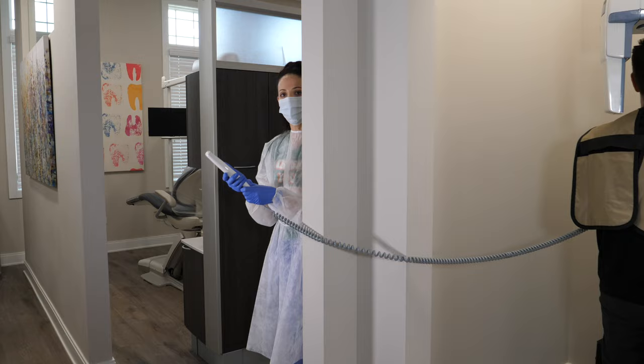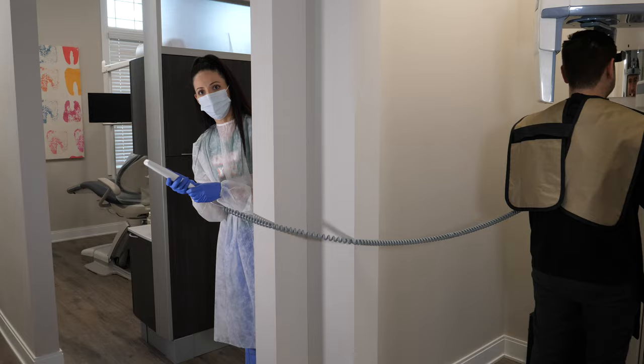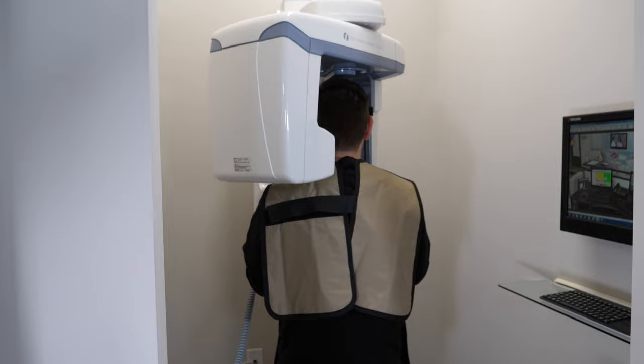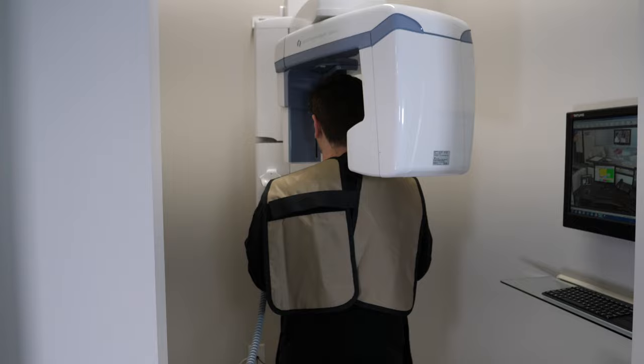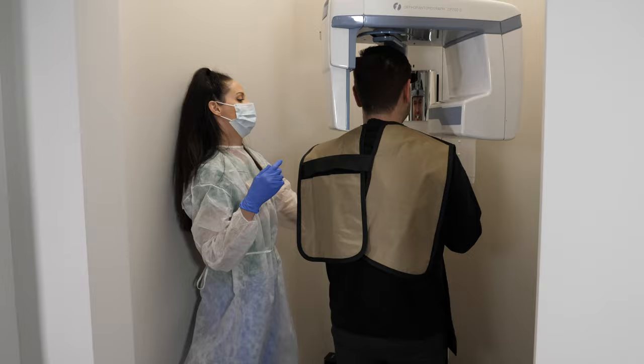Once you are all set up, they will walk out of the room, or at least a six-foot distance away from you, and press the button. The machine will go around your head. It usually takes less than 20 seconds, but every machine may differ slightly — however, it won't usually be more than 30 seconds. When the x-ray is being taken, you will usually hear a beeping noise while it moves around your head. Once it stops, you're done.